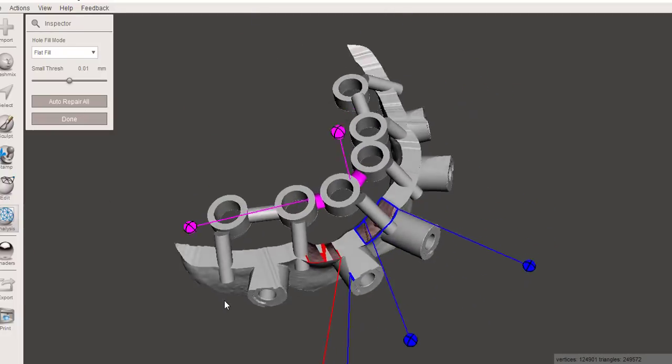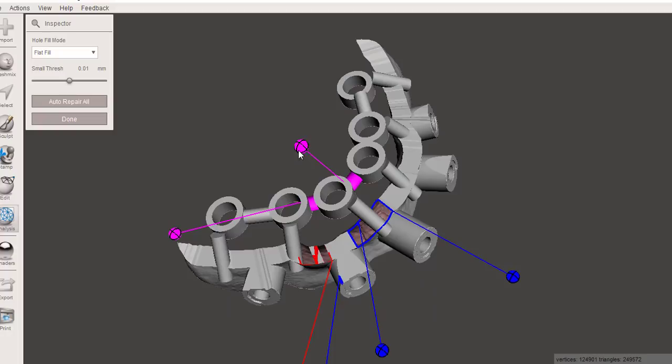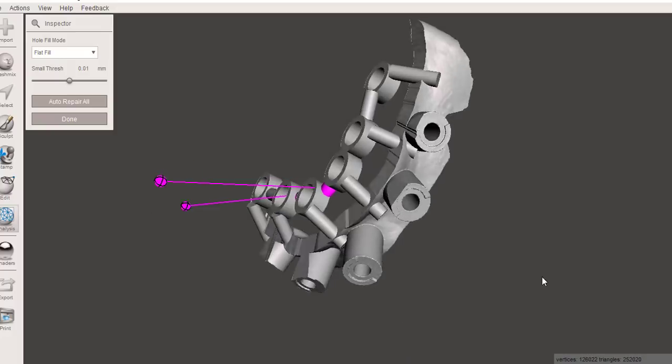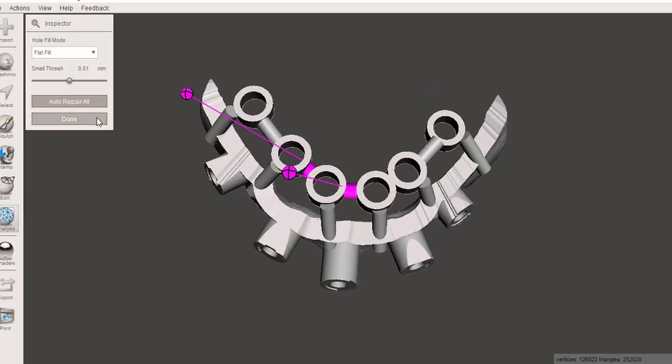But now one of the things it sometimes highlights, and I'm not sure the reason for this, is some of your connectors. You don't want to get rid of those. So don't just hit Repair All because it'll delete those. Rather, come and just individually click the holes where there's a mesh error that needs fixing, like so, and now everything is watertight and this will print perfectly.